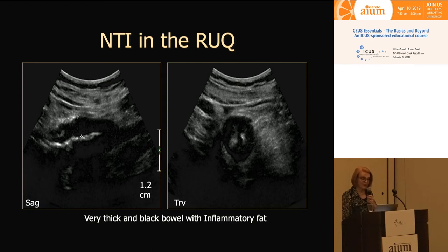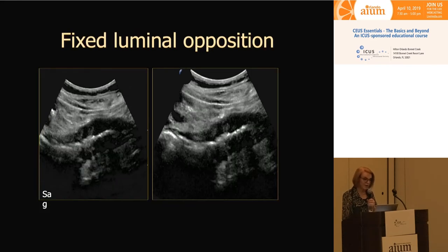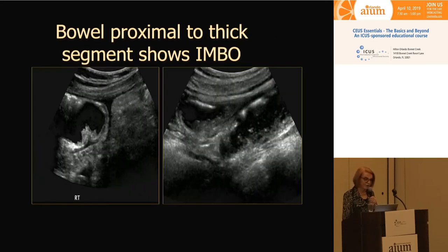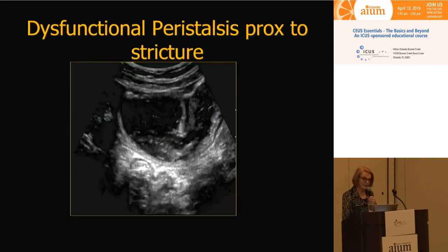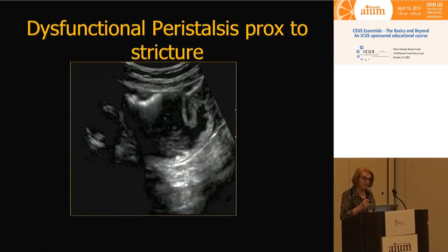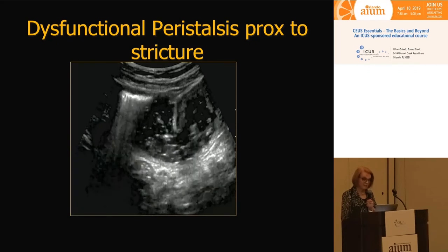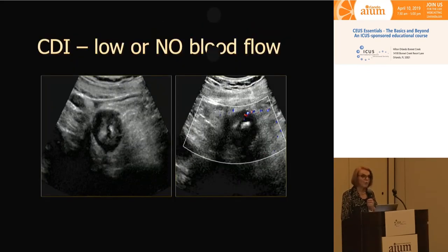This is a 49-year-old male who has had Crohn's disease since 1982, presenting with obstructive symptoms. He's been on no medication for many years and had one prior surgery — a right hemicolectomy. Looking at his neoterminal ileum, his bowel has no bowel wall layers and is grossly thickened to 1.2 centimeters. This very thick bowel with no wall layers shows fixed luminal apposition over about 12 to 15 centimeters, looking like a big stricture. Looking at the bowel proximal to that thick segment, there's evidence of incomplete bowel obstruction — with anterograde and retrograde peristalsis in the same loop, which are never normal observations.